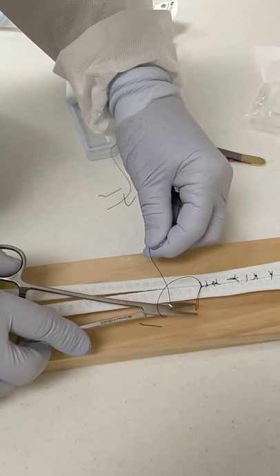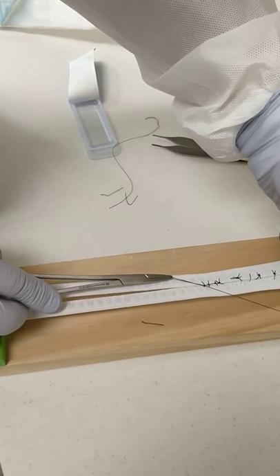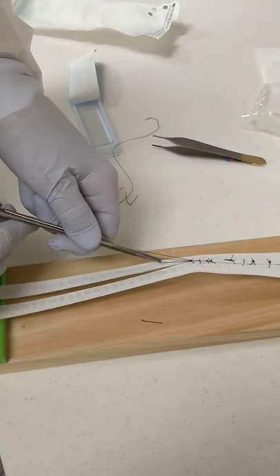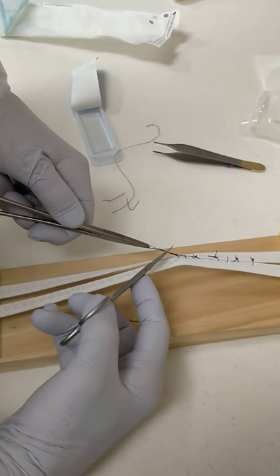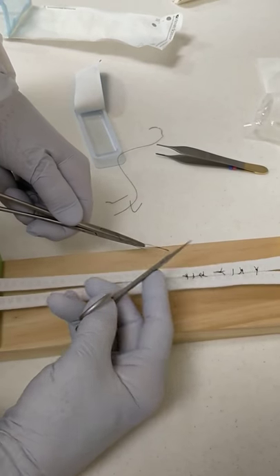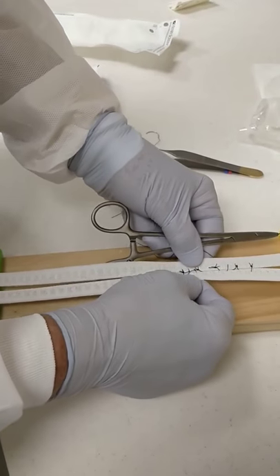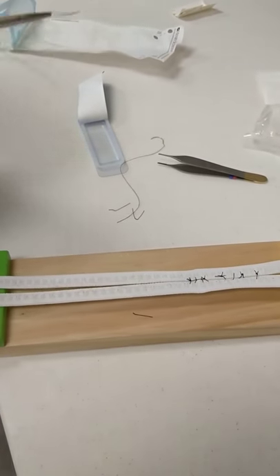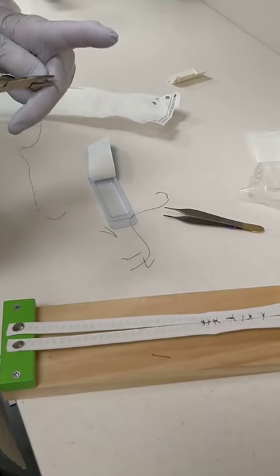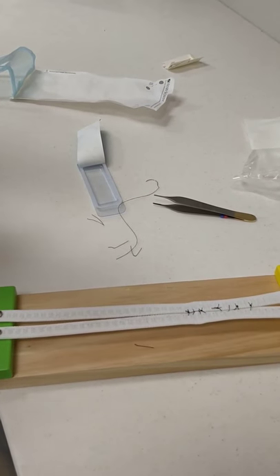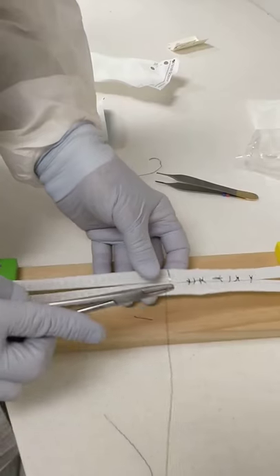But basically, that is the continuous locking suture, then there's just a continuous non-locking suture.